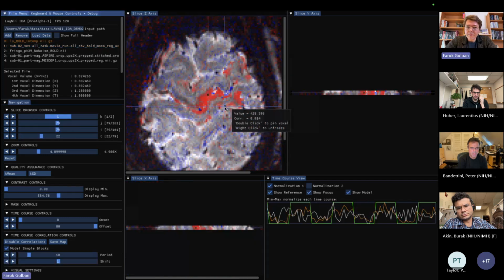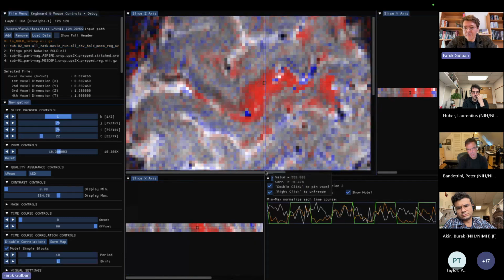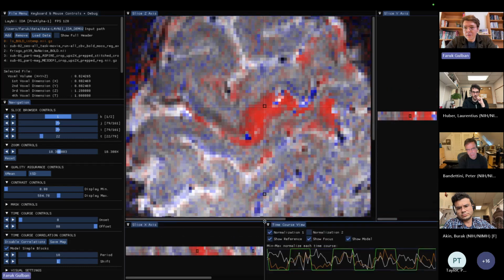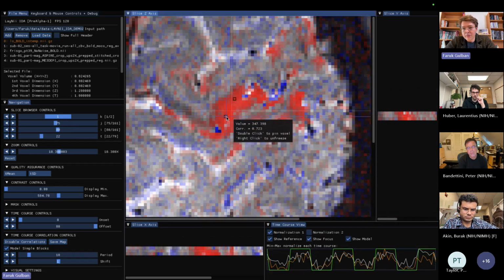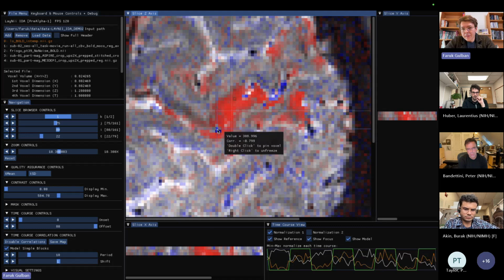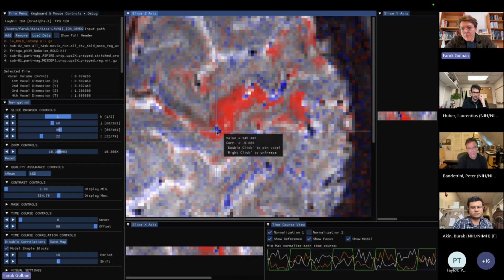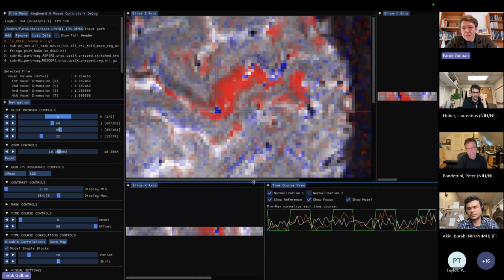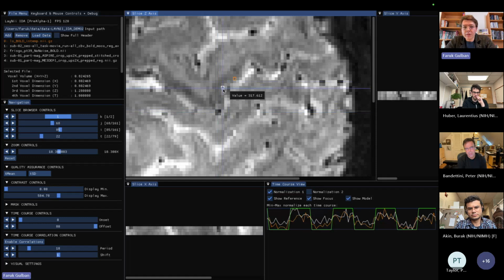And finally, thinking back on the LayNii test data, I have noticed the following. We have the task activity modeled here very simply, but there are these little blue dots around, you see? One of these dots is definitely a vein because it looks dark. This is a vein in T2 star weighted data. This is just the BOLD data; I'm not showing you the VASO data.